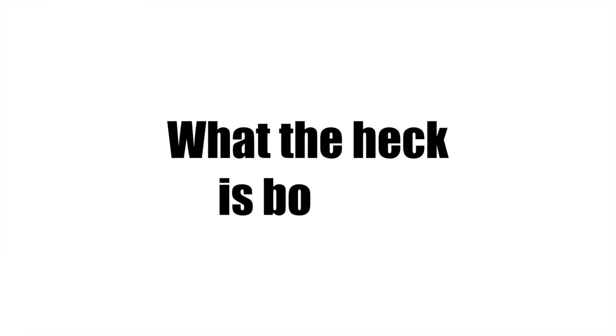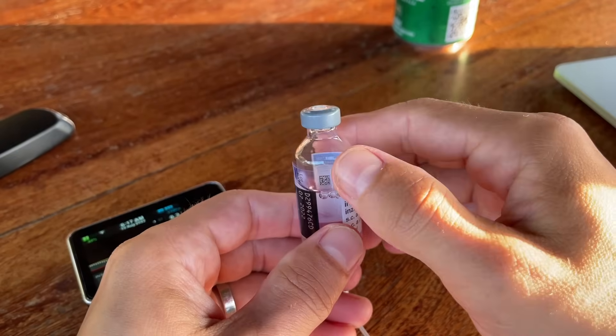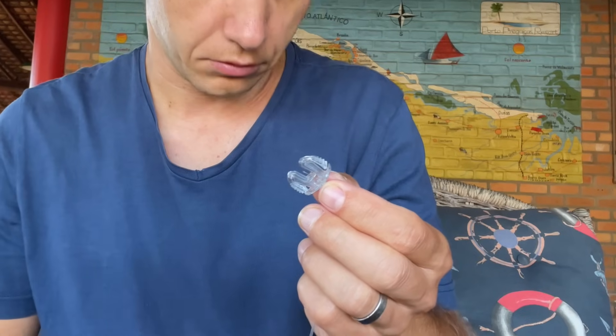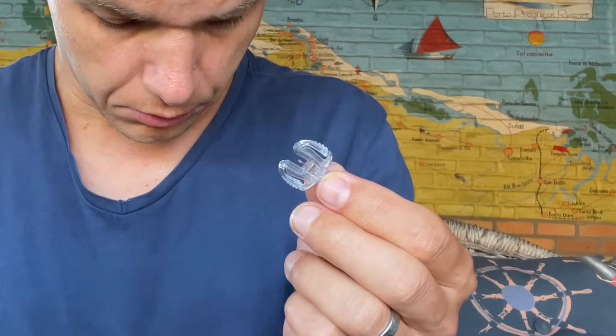For those who don't know what bolus means: on an insulin pump you only fill it with one kind of insulin, typically rapid-acting. The pump continuously delivers a small pre-programmed amount of background insulin called basal. When you're about to eat a meal you tell the pump to give you a little extra insulin to cover that meal — that extra shot of insulin is called a bolus.